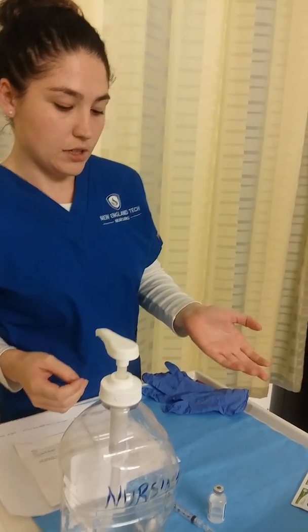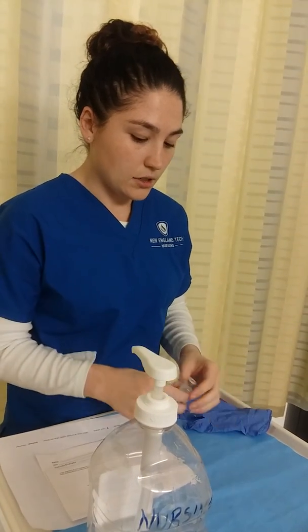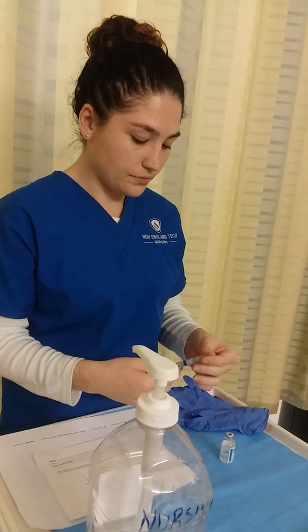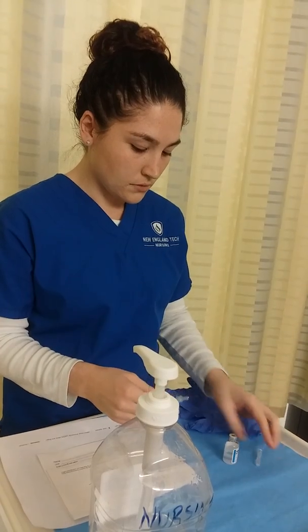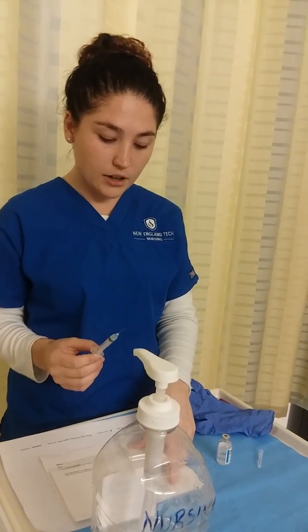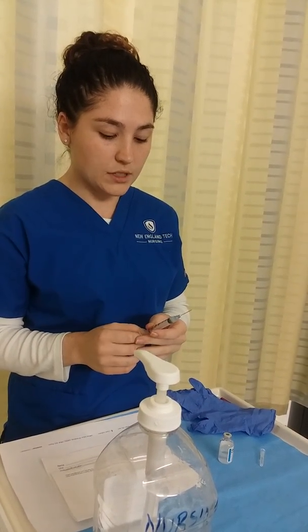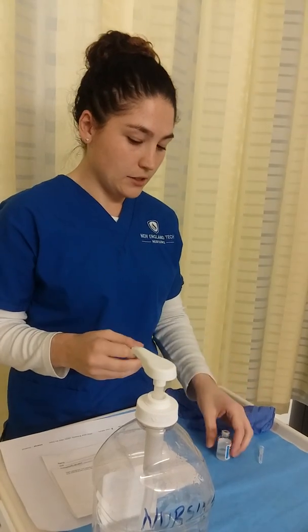And then I would make sure to check my medication, the expiration date, and I would start to prepare my medication. I'm going to be administering 1 milliliter out of a 3 milliliter syringe. So it will be about 6 seconds per line.